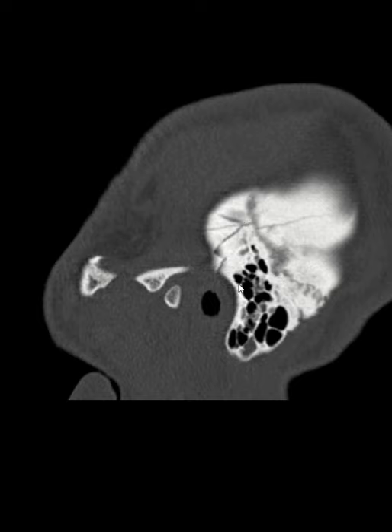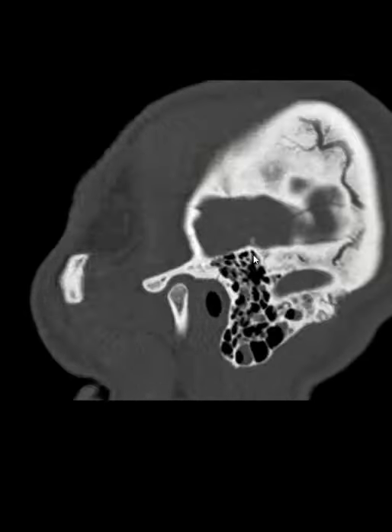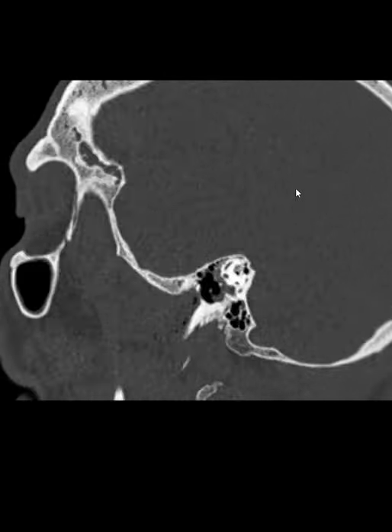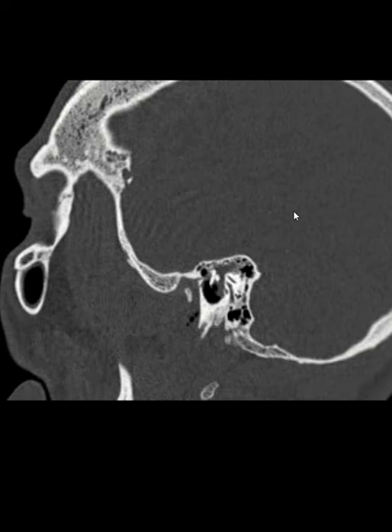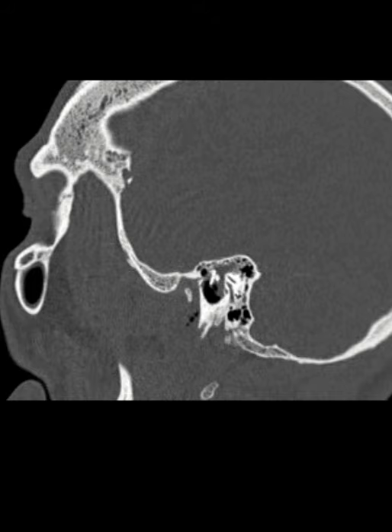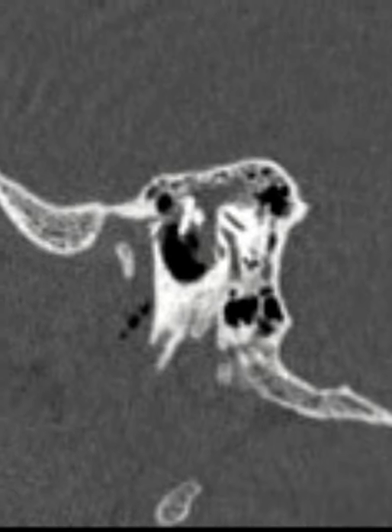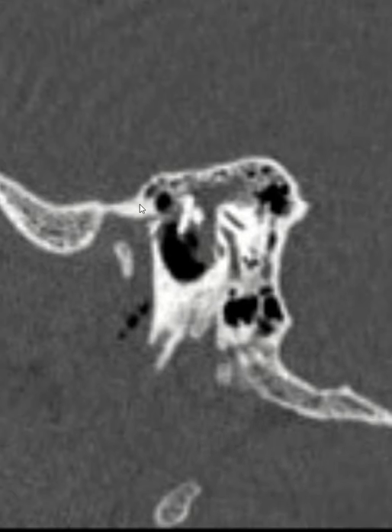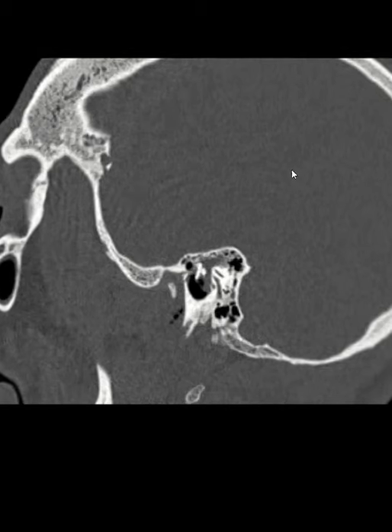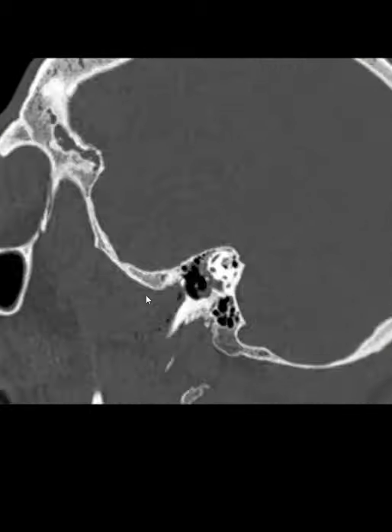You can see the fracture here, going like this, and you can see the hemotympanum right here. Thank you so much for your attention.